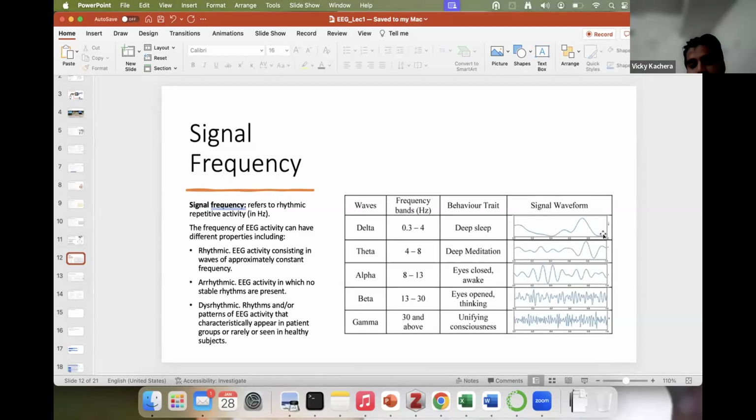Okay. Yeah, so these are two different things, you're getting confused. Sampling rate is how many times did you measure. You have to measure a large number of times in a second, you can measure 2000 times. But what are you measuring? You're measuring signal. When you plot the signal versus time, you cannot see 250 peaks in 250 data points. That makes no sense. A peak won't show up for every data point. So you will see some peaks, and you will hopefully see somewhere between 0 to 40, 50 peaks per second. That is your frequency in the observed data, the frequency of the signal.